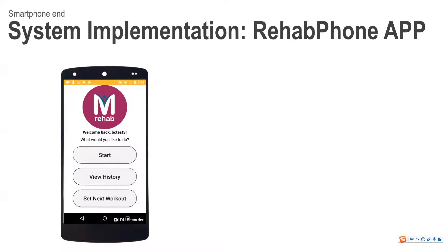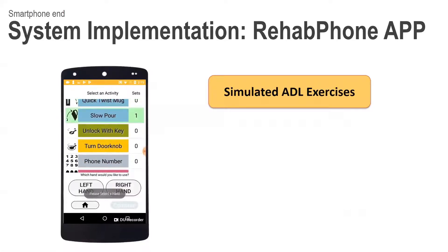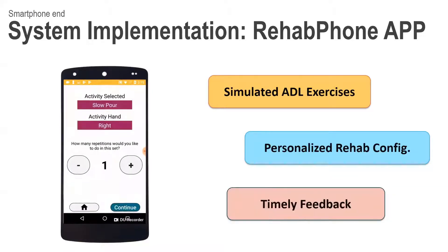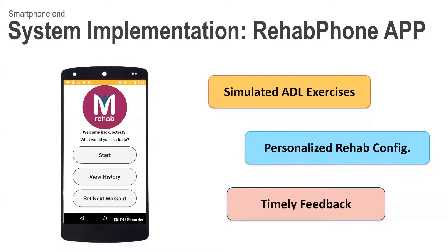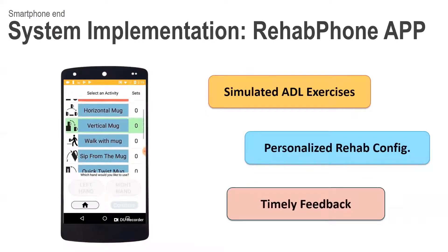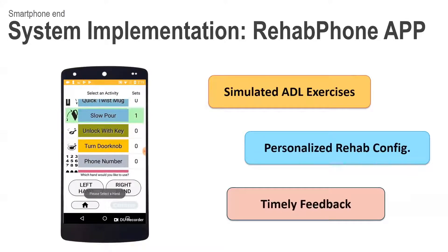Now let's look at our implementation of Rehabphone. First is the software part. We developed a mobile app to turn the in-home rehabilitation into a more interactive and informative experience. The app has a neat UI that can guide the user through the rehab process. It contains a list of daily activities and lets users select their rehab preferences, such as intensity. Afterward, we leverage the onboard sensors to track motion and provide timely feedback.